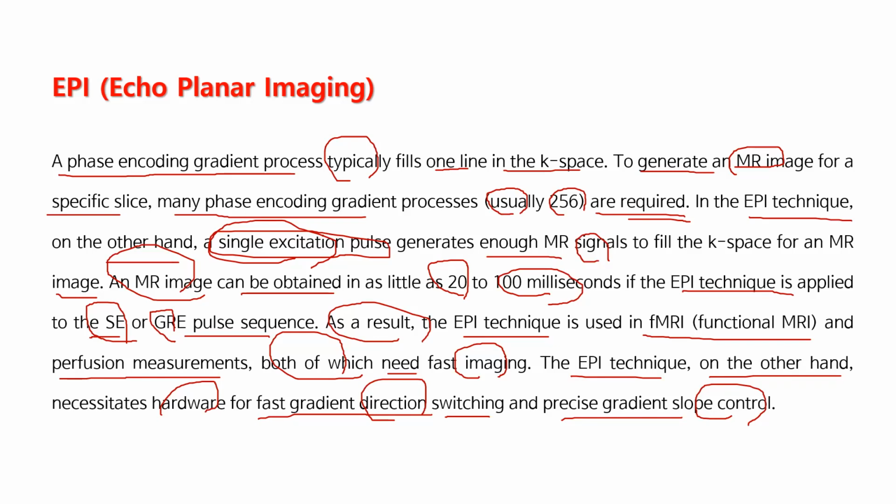So previously we discussed the gradient echo GRE pulse sequence and FSE, fast spin echo pulse sequence.